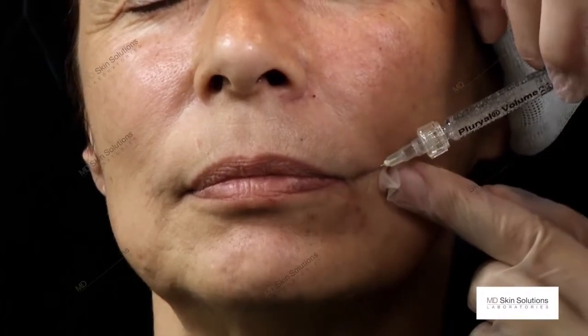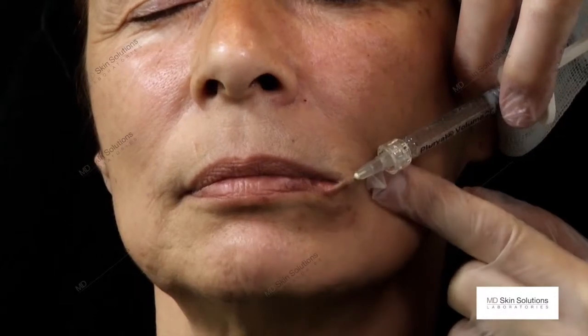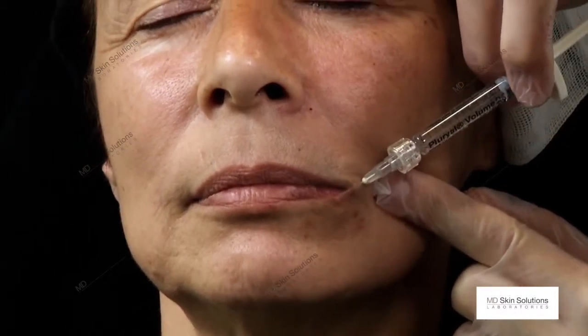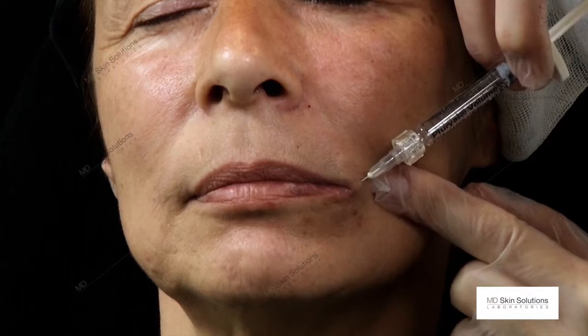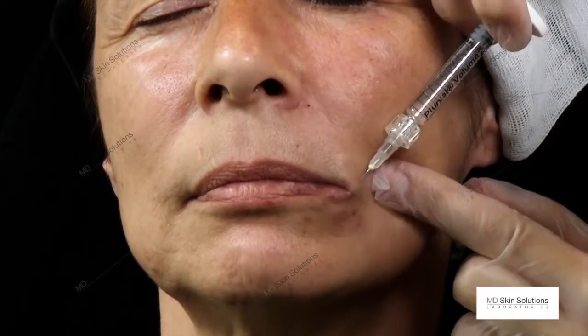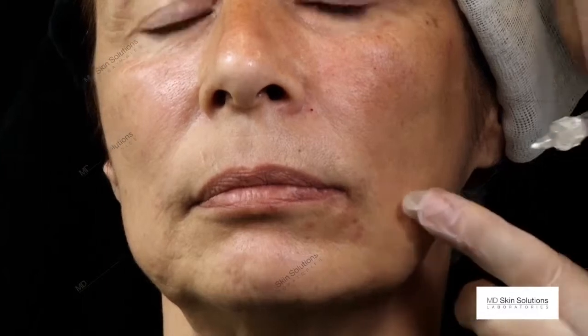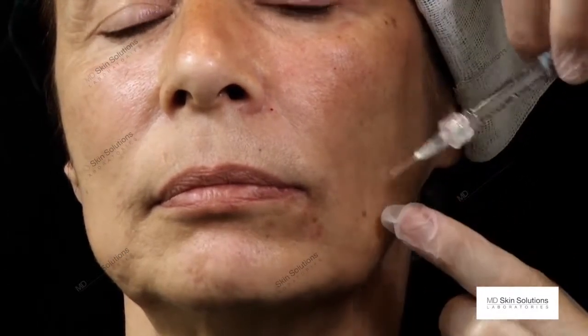The second injection will redefine the corner of the mouth. I needle up the red-white line of the lip, and I do inject gently with a gentle pressure on the plunger, just this little line in order to lift up the corner of the mouth. It's like building a house, doing a foundation to re-give volume where it is lost, and then to redefine by giving a topping, again with the Pluryal volume, which is a very suitable filler for this indication.